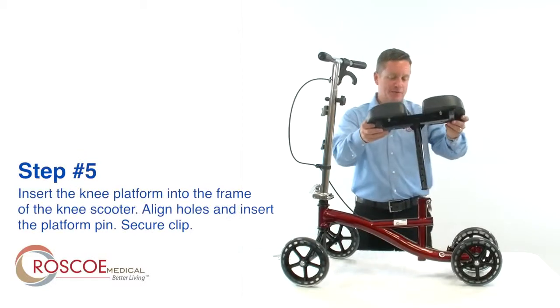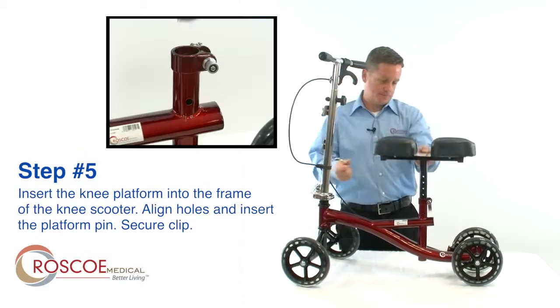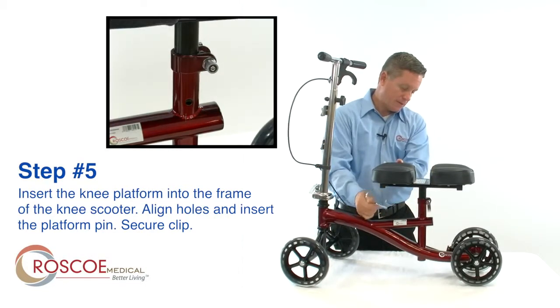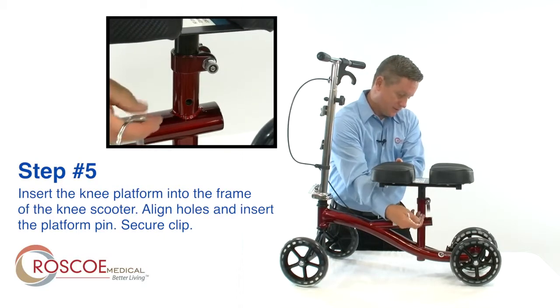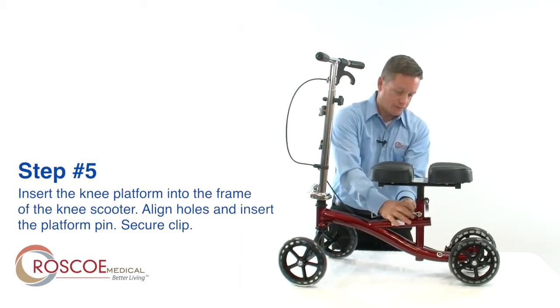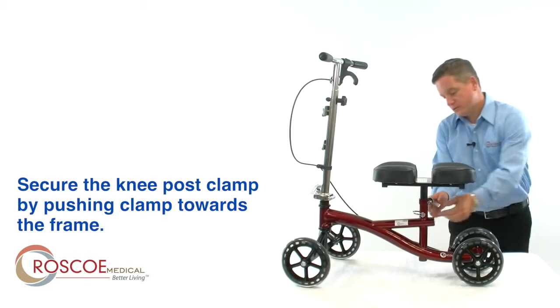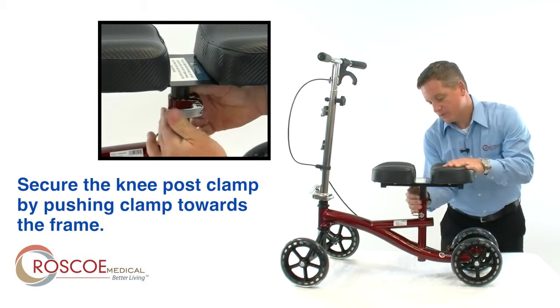Step 5: insert the knee platform into the frame of the Knee Scooter. Make sure your holes are properly aligned to the frame, then insert the platform pin into the frame and secure the clip. Next, secure the knee post clamp by pushing the clamp towards the frame.